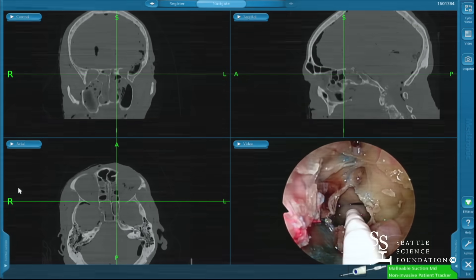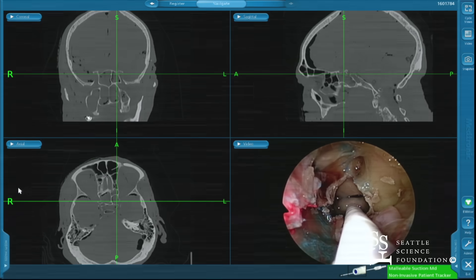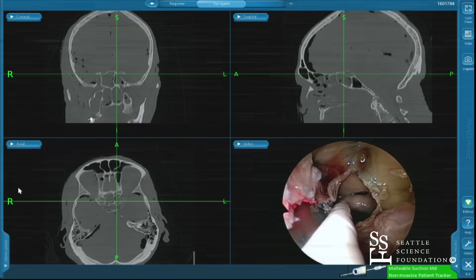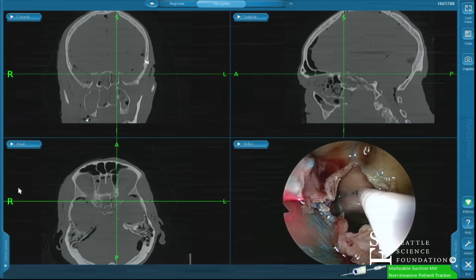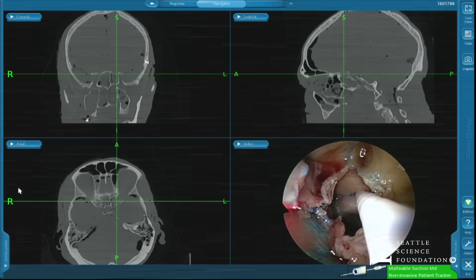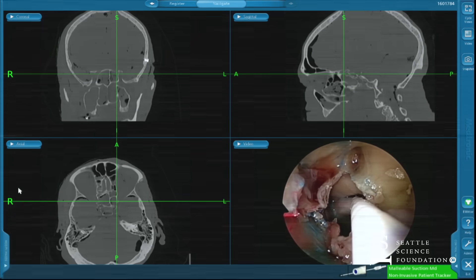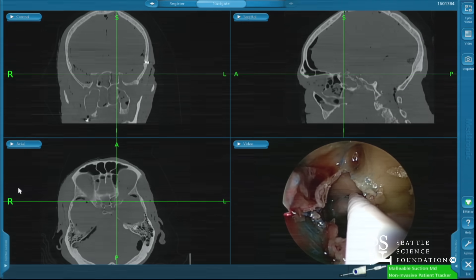We have our navigation on the screen now. I'm just going to go straight back and point towards this — you can see I'm pointing straight back. We have our sellar region here. I'm going to try and get to right in this little recess. On that coronal, this is a perfect example of our optic carotid recess. Our optic nerve is up here going across, carotid coming down below. It's a really good specimen to show that. You can see it best on the coronal plane, and also on the axial a bit.